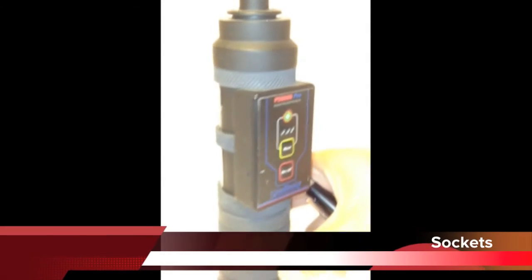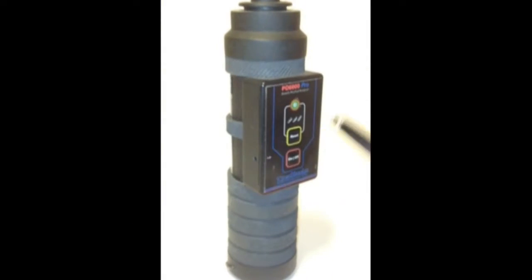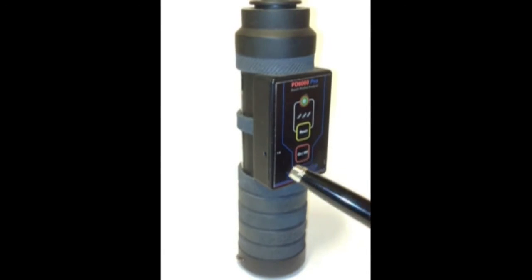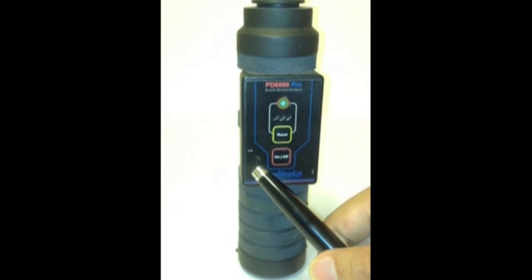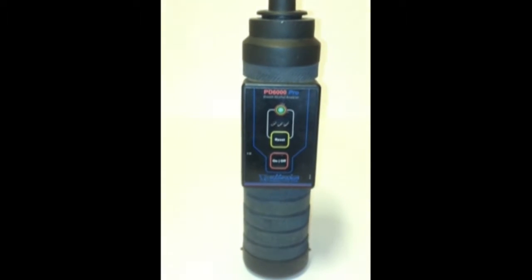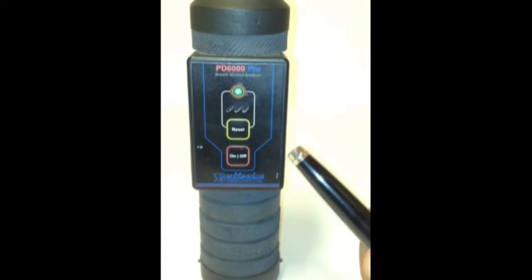The charging socket is marked by a charging symbol indicator. The charger plug fits into this socket, and charging is confirmed by a red confirmation indicator that glows once charging begins. Secondly, there is a low battery indicator which glows red when the batteries are low and the instrument requires charging.